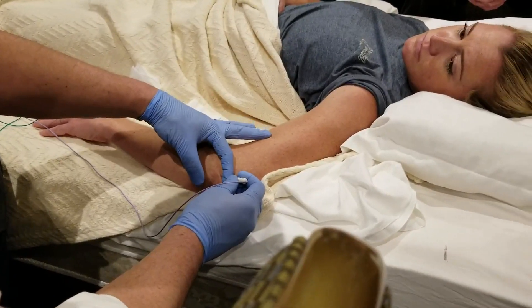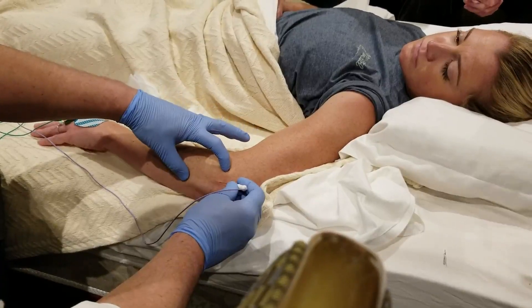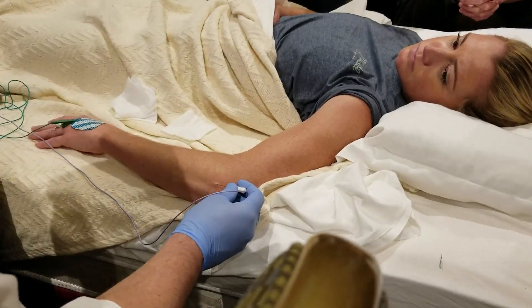The line is from here to here, and then down to the third point of the triangle.